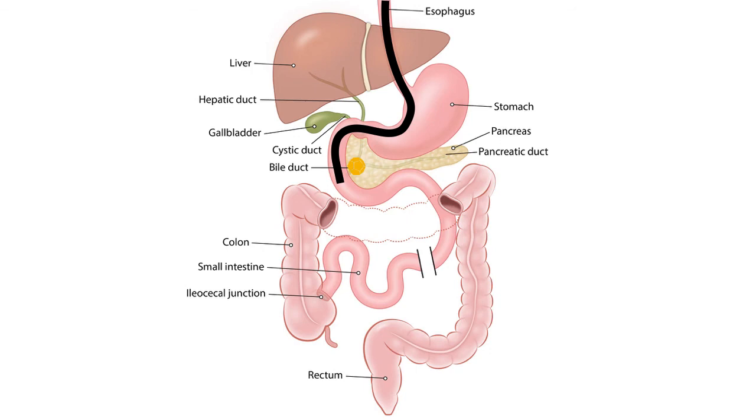Here we want to get into the bile duct, so you pass a catheter up the bile duct and then inject dye so that you can see what is happening with the bile ducts under X-ray control or fluoroscopy control. So, the dye goes up, you can see that under X-ray control.